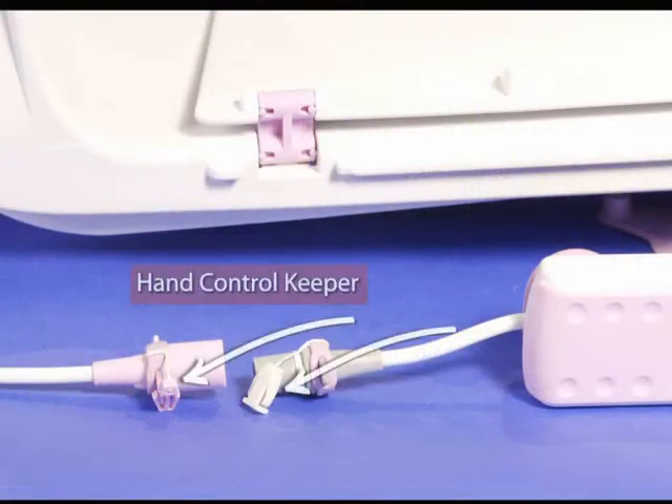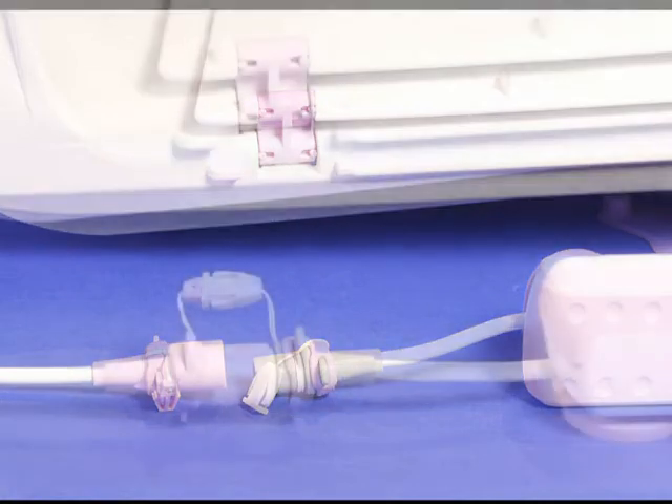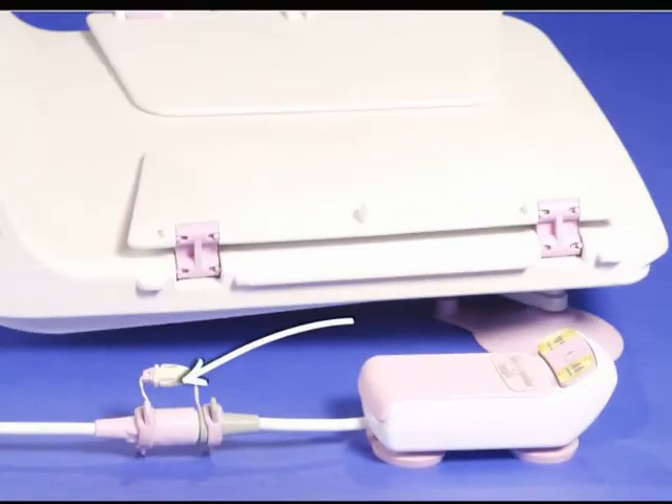The hand control keeper acts as a safety to prevent the hand control from accidentally disconnecting from the cord to the bath lift. Just snap the two pieces together. To disconnect the hand control, push the two release buttons at the same time.